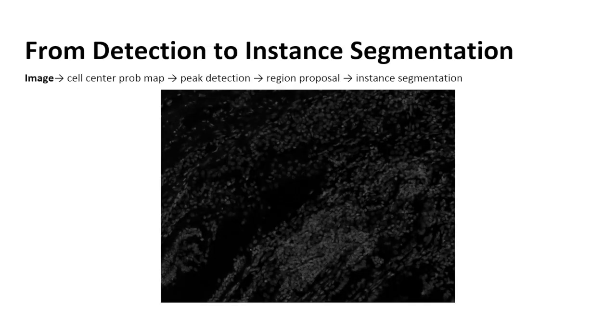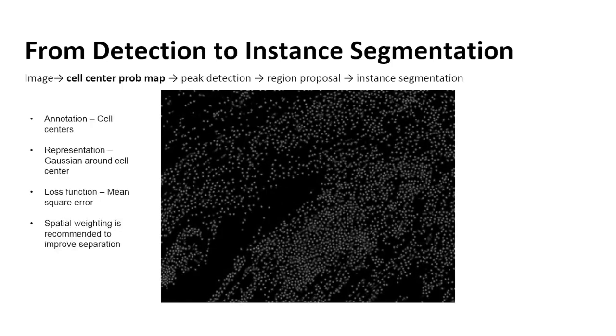You have an image, and again, we found we don't really need, or it's not really advisable to do all that much pre-processing in most cases. You need annotation of your cell centers. So you would think this could be a very time-consuming process. Obviously, you don't want to pay a pathologist to mark these cell centers with their mouse one by one.